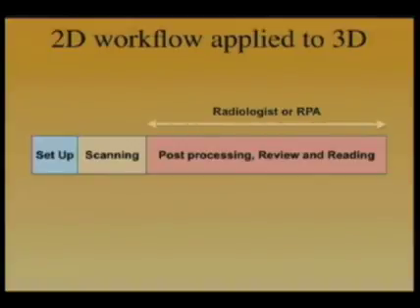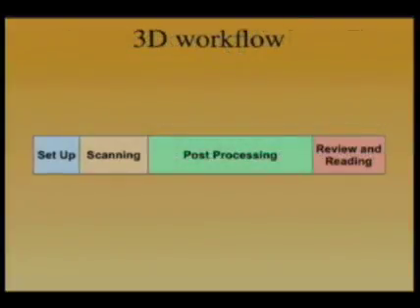But if the radiologist or the radiologist surrogate does that, that could take a long time, much longer than they're spending reviewing and reading right now, and that's not a good thing. So in a 3D workflow, you would introduce an intermediate step of post-processing that I've shown here, and that post-processing would be done somewhere and by somebody who's yet to be identified.